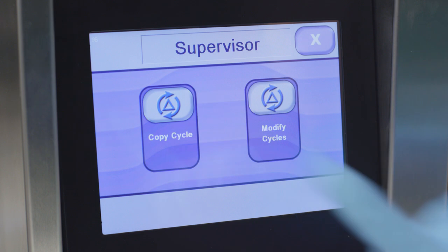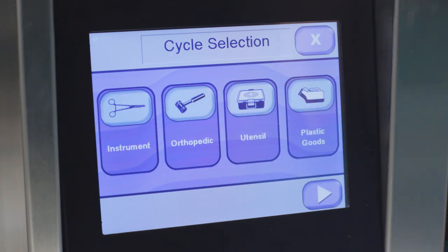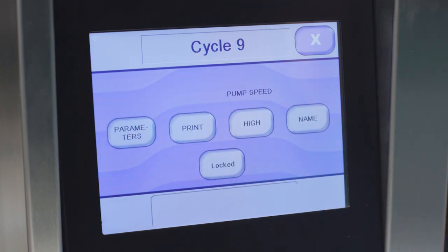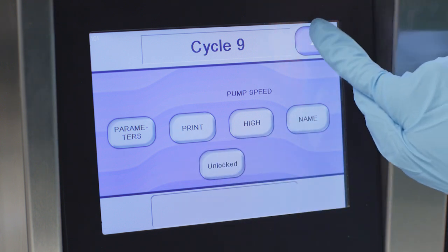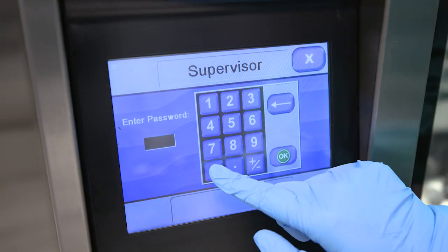Refer to Section 5 in your AMSCO 7052HP and 7053HP washer operator manual for details on what attributes can be modified and ranges allowed. To modify a cycle, press cycles, then modify cycle, using the arrow buttons to navigate to the cycle you want to modify. You can lock or unlock a cycle, change a barcode number, or modify a phase. Once you've made your changes, press the close button until you return to the desired screen.